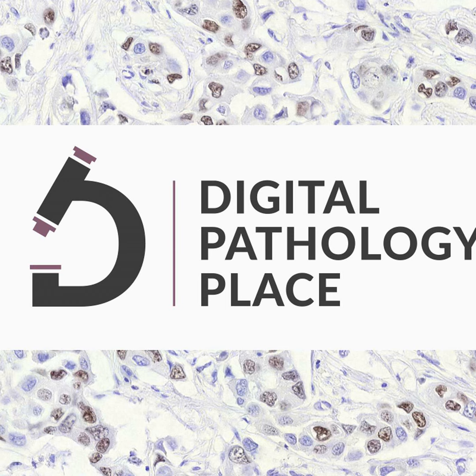And the way you traditionally do it is you take patches of normal tissue, patches of abnormal tissue. You feed that to your deep convolutional neural network, and obviously these patches are based on detailed annotations by a pathologist. Then you can train a deep learning system, a convolutional neural network, to learn what is tumor and what is not tumor. And then you can apply that to a whole slide image and you get a resultant likelihood map or segmentation, whatever you want. For lymph node metastases, if you have fully annotated slides, that works pretty well for small metastases, but also for large ones.